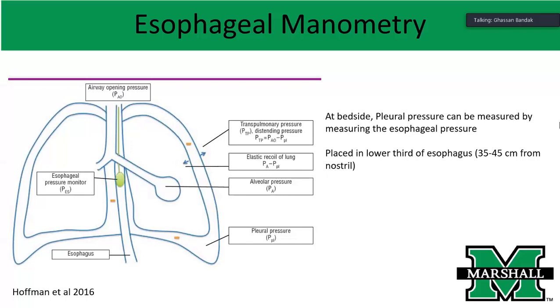However, in certain conditions, the ones we talked about, a plateau of less than 30 may not apply, you can go beyond 30 simply because there's a major component of that measured pressure that is not truly affecting the lung. So to do that, you have to estimate the pleural pressure.